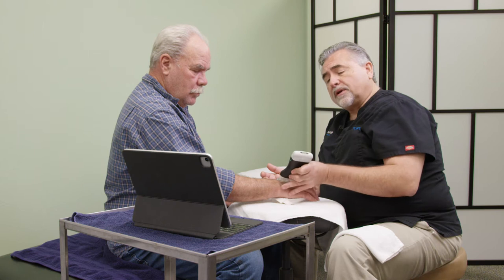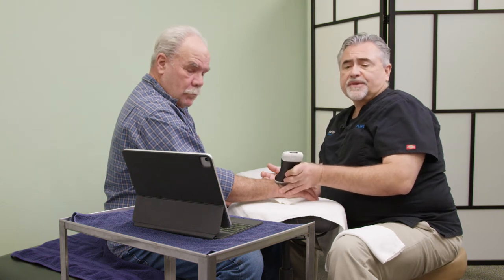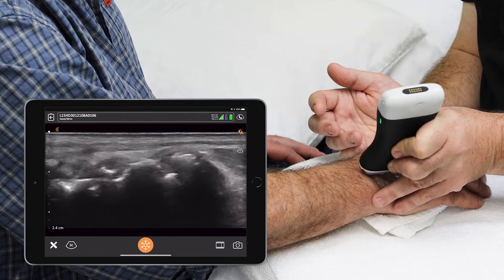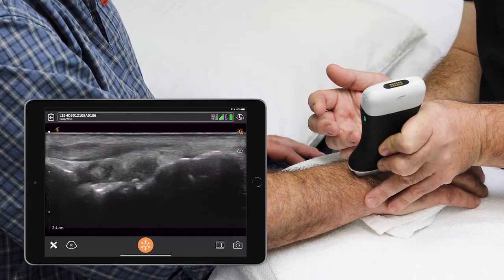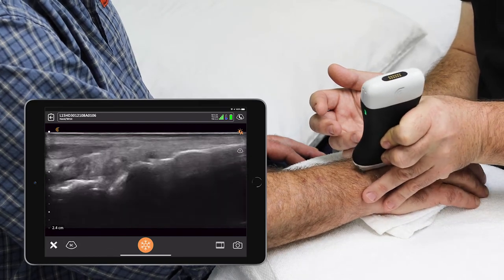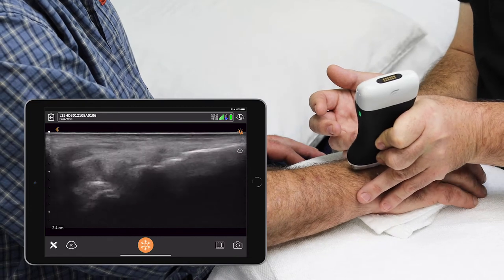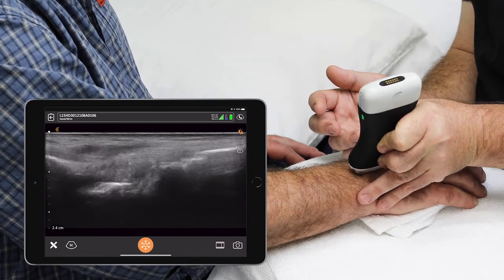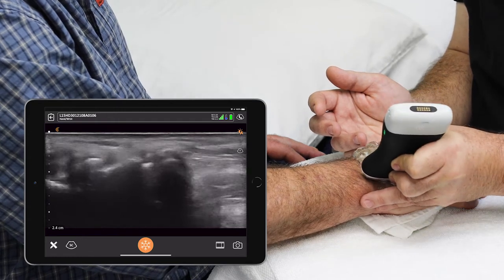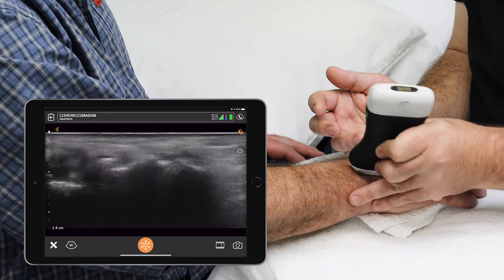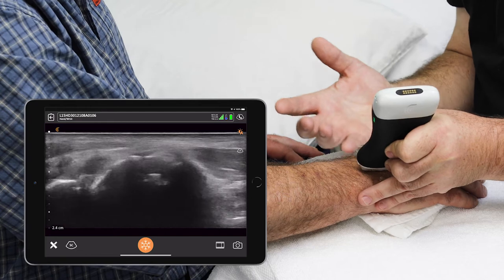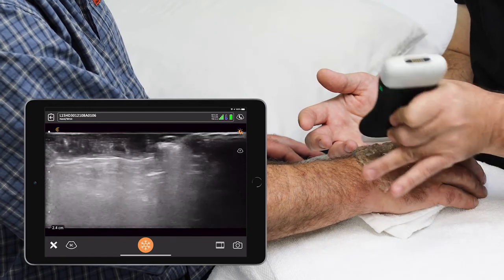Simply taking the probe and going long axis on the back of the wrist, we're going to be able to see the white hyperechoic echo texture of the wrist joint. You can see just with this easy scan on the back of the wrist what the carpal bones look like, and unlike a young healthy wrist, you're seeing debris around all of the different carpal joint regions and darkness showing effusion and the amount of irritation that surrounds that.